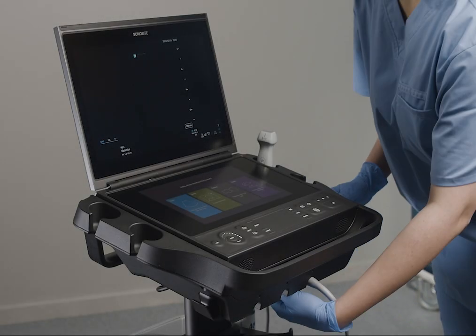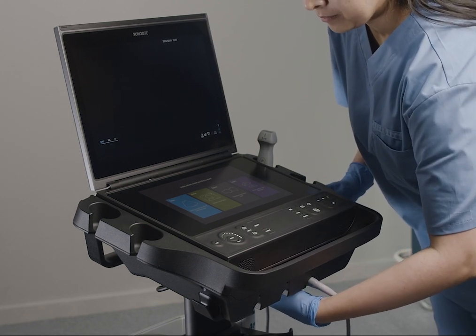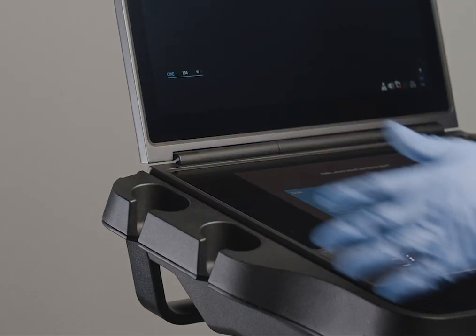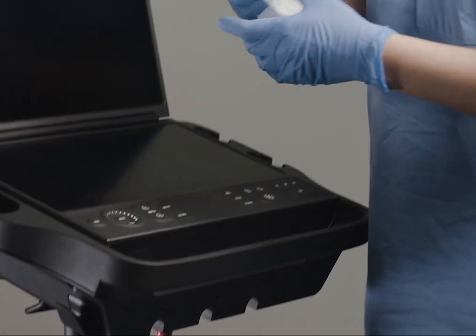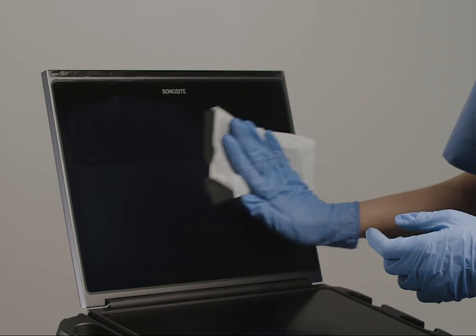Let's start with cleaning the system, stand, and platform. Before cleaning, you want to make sure to turn off the system and disconnect the transducer and any other accessories. Use a pre-moistened wipe from the list of approved cleaners and disinfectants to clean the exterior surfaces of the system, stand, and platform.